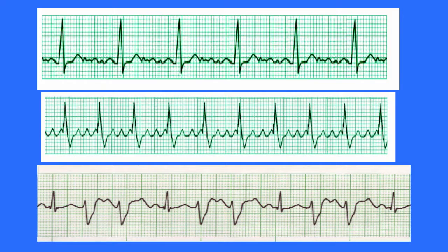The distinction between these two is not quite as good as it could be. You'll see on a lot of the practice strips later a better atrial fibrillation, atrial flutter distinction, but this does give the idea of the kind of baseline that's not very consistent versus a nice flutter baseline. So the first one is atrial fibrillation, second one is atrial flutter.